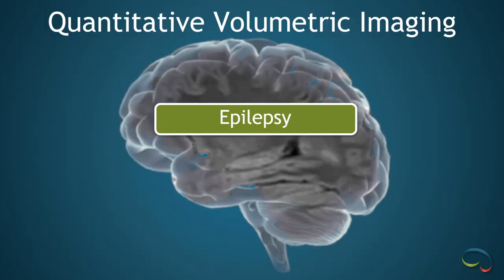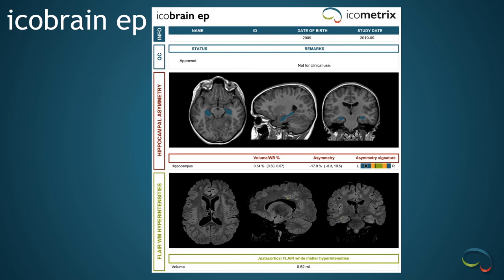Now let's take a look at the brand new epilepsy report. This is the new IcoBrain epilepsy report, which is still FDA pending but hopefully will be cleared for clinical use in the next few weeks. This shows the hippocampal volume with respect to the whole brain volume percentage — it's actually normal in this patient. However, the asymmetry report is abnormal at minus 17.9%, which is statistically significant. So the left hippocampus is significantly smaller than the right, despite both having a normal volume. In this patient, you'd want to look really carefully to screen for potential left-sided mesiotemporal sclerosis. It also gives us a FLAIR white matter hyperintensity volume, which can be useful both for mesiotemporal sclerosis and for assessing for very subtle cases of focal cortical dysplasia.